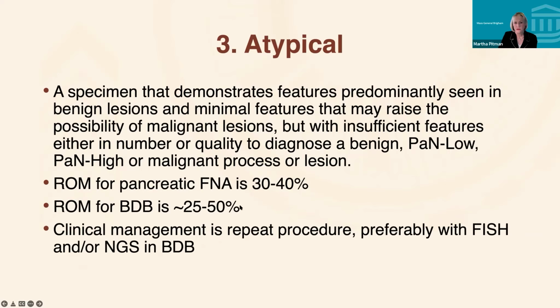And because we are very conservative, at least I'm very conservative in my interpretation of bile duct brushings, because of the known underlying inherent inflammatory and reactive changes that can occur from the lesions in the bile duct. Stents are often in place. In PSC, there's an inflammatory background, so have a high threshold for malignancy. We don't want to be wrong when we say something is malignant. Clinical management is to repeat the procedure, preferably with some type of ancillary study, FISH, or next-gen sequencing. At Mass General, we co-test all of our bile duct brushings with next-gen sequencing because they're so difficult to interpret.